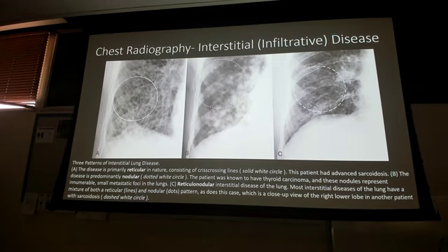Are you talking about all the masses in the mediastinum? The anterior, middle, posterior? More just kind of how to really discern what's really there. So I was scrolling through Radiopaedia last night, and I found one that was a carcinoma.